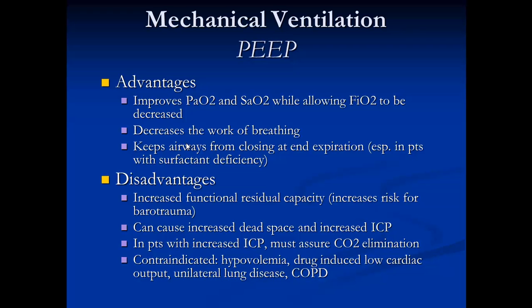COPD is a concern because COPD has an emphysema component, so you have to be very careful as to how high you go on the PEEP, because remember, it increases pressure at the level of expiration in the alveoli, and increases the risk of barotrauma even more if the patients already have severe or advanced COPD with bulla. They could provoke a rupture of a bulla and pneumothorax. It doesn't mean that you won't use it. If you must use it, you just have to be careful how high you go.